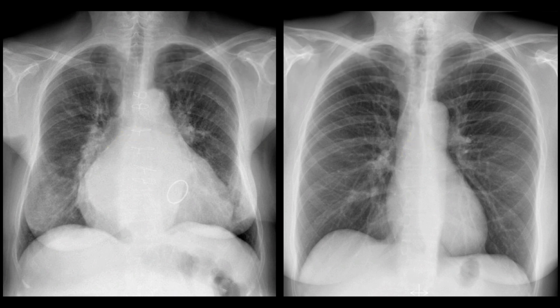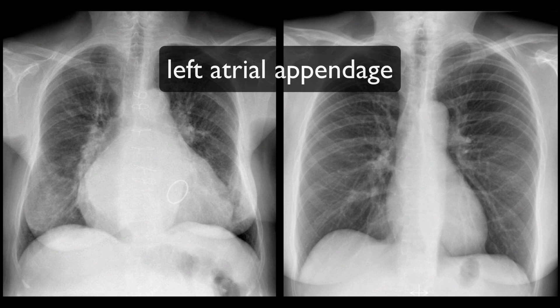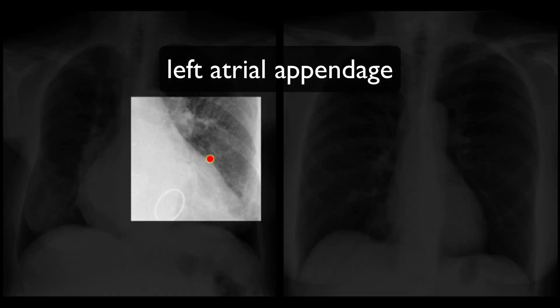The final sign of left atrial enlargement we'll be discussing on the frontal radiograph is bulging of the left atrial appendage. Normally the left atrial appendage contributes to a flat, or slightly concave, upper aspect of the left heart border. When enlarged however, the left atrial appendage creates a discrete, convex bump.